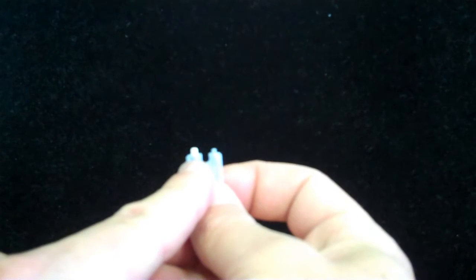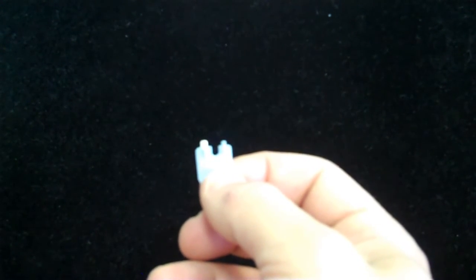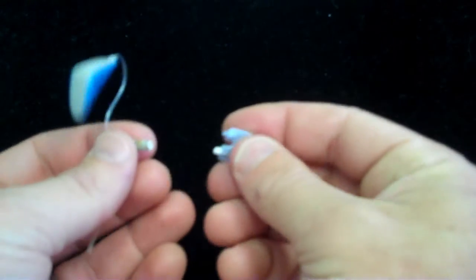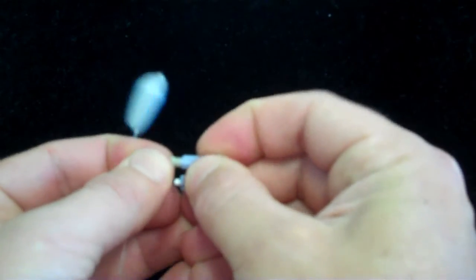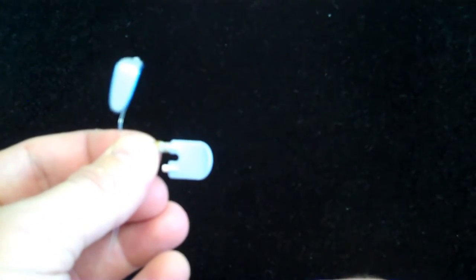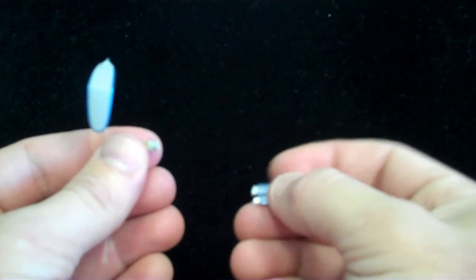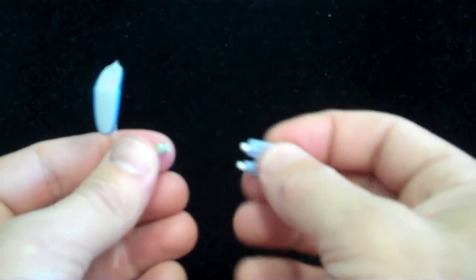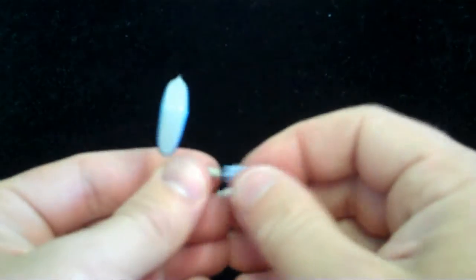One side of the tool has a new filter. The other side of the tool has a hook to remove the old filter. We'll take the side with no filter on it, just the hook, and push that directly into the existing filter. We pull, removing the old filter. We turn the tool around, push the new filter down into the hole, and remove. And we've just changed the filter, the wax basket, on this Oticon product.